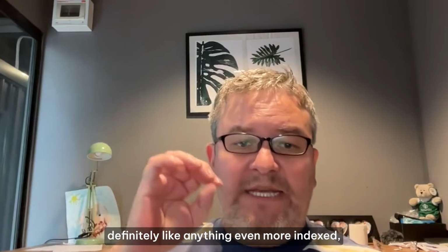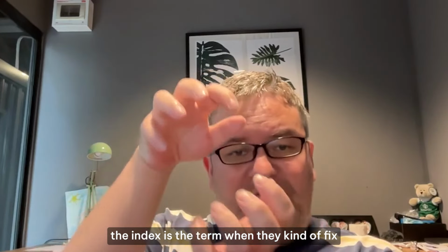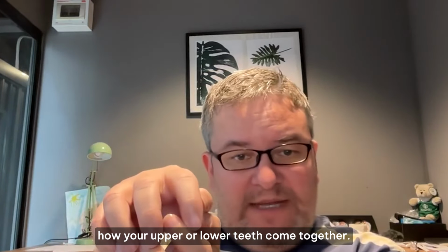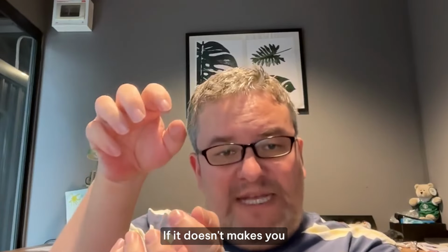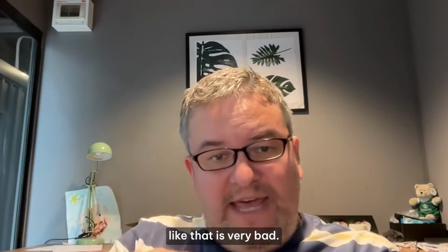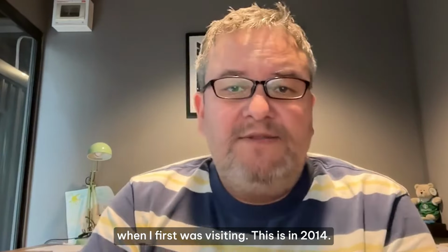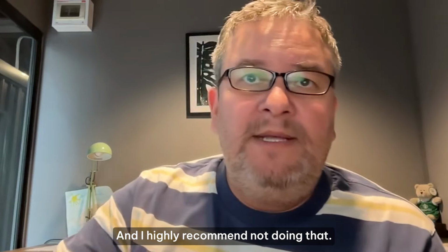Definitely anything even more indexed. Index is the term when they fix how your upper and lower teeth come together. So this is a dental term. If it makes you a hardcore index splint that holds your jaw in one spot, that is very bad. And I've used those when I first was visiting dentists in 2014, and I highly recommend not doing that.